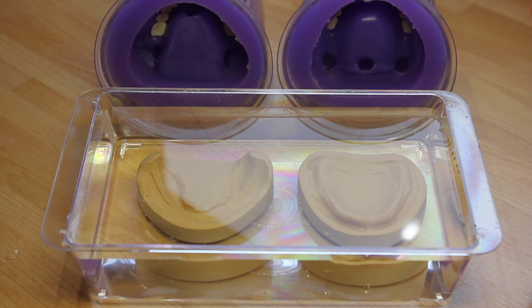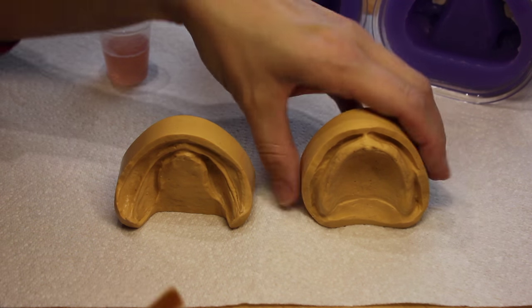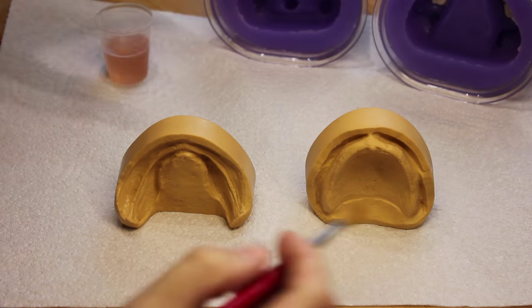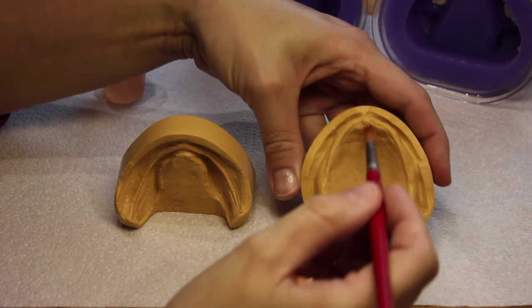The casts then need to be soaked until they are thoroughly saturated and not producing any air bubbles. Once the models have been well saturated, give them a very brief airline and then paint them with plaster-separating medium.